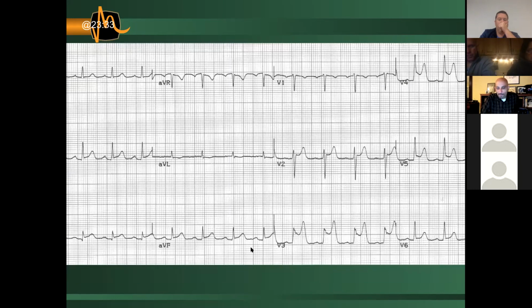Hey, Joe. Yep. With that hyperacute T wave, is there any way for me to differentiate hyperkalemia as opposed to the ischemia? Not a great one, Ian. Sometimes we talk about the hyperkalemia ones as being a little more pointy, like a little sharper at the tip than the hyperacute T wave. But other than that, there isn't really a good way to separate the two. Mike, any tips on that? I called a hyperacute hyperkalemia STEMI 3 days ago, so no, it's hard.